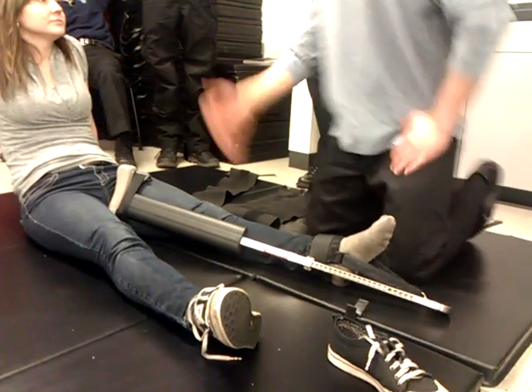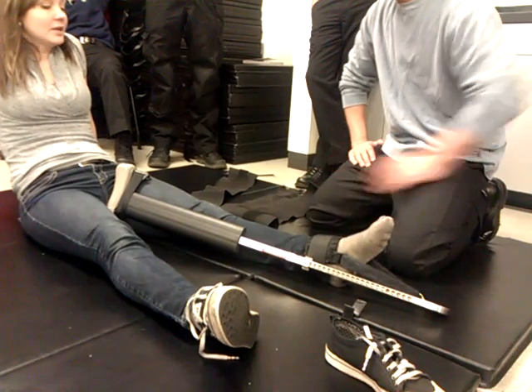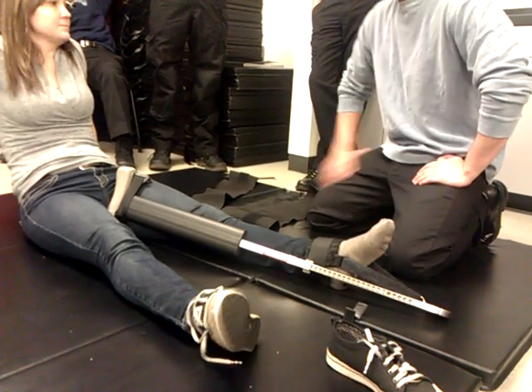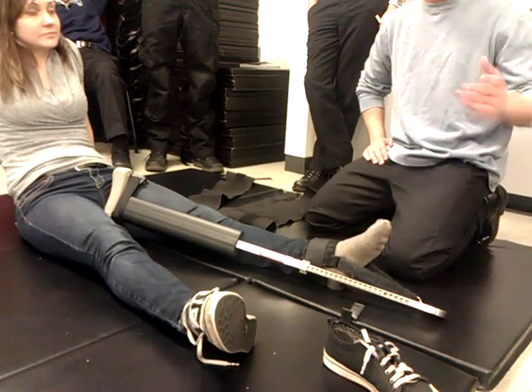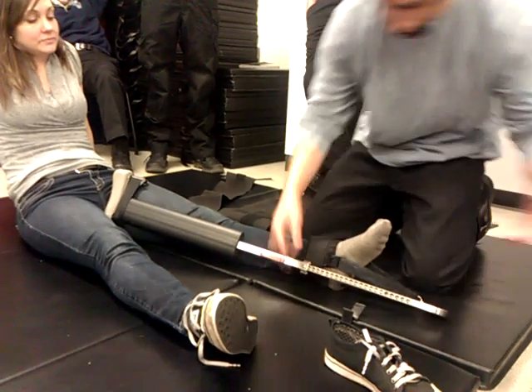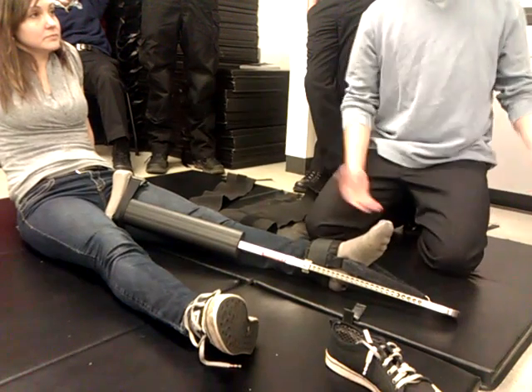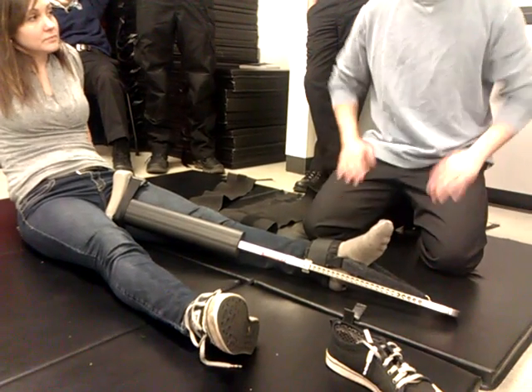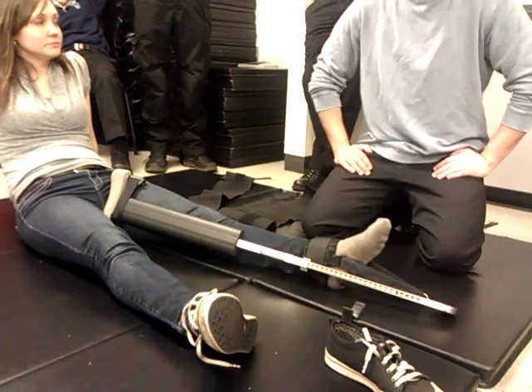So, ma'am, in order for me to apply the appropriate amount of traction, I'm going to have to go ahead and ask you your weight. 140 pounds. So how much pressure are we going to be applying? 14 pounds. So for this, we're not pulling full traction. Click, click, click. I'm setting it to 14 pounds. You're going to be telling your proctor, I'm pulling traction. I'm pulling 14 pounds of traction on the device.